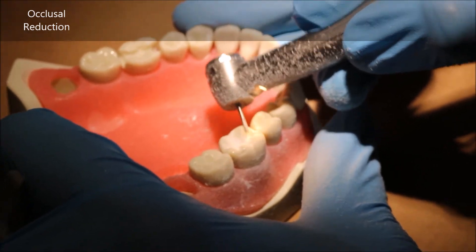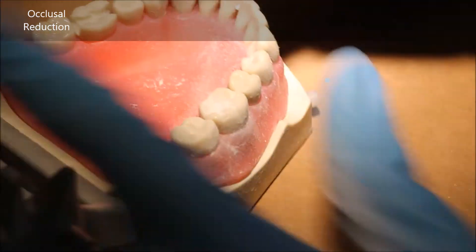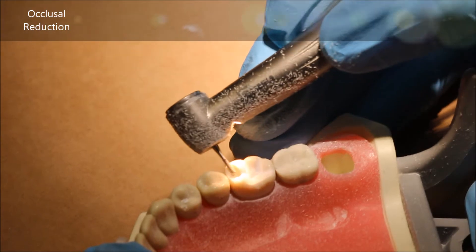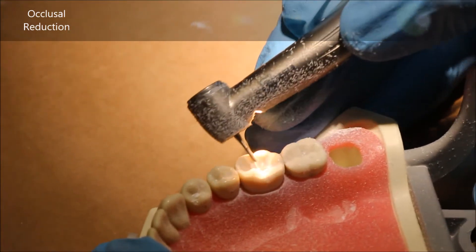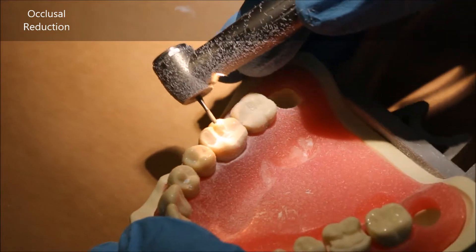Now I'm doing the mesolingual cusp here, and you proceed this way along the entire occlusal table until you get around one to one and a quarter millimeters of reduction. We eventually want to end up with one and a half.